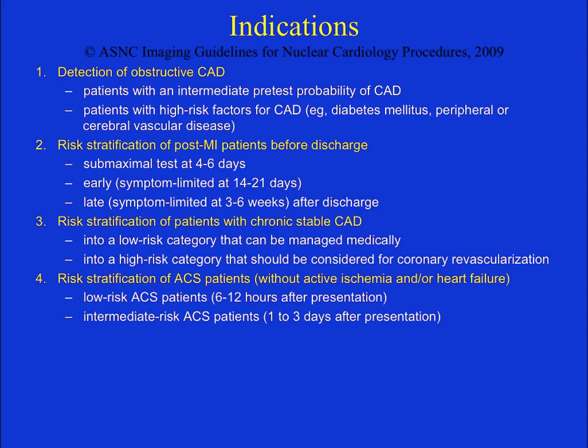Okay, let's go one step ahead. Let's assume that the patient underwent some thrombolysis. Now, after thrombolysis, we can again inject the tracer to the patient and do the imaging again. So we get the post thrombolysis image, and these two sets of images, the previous image, that is the image when the patient was having chest pain, and the later image, that is the post thrombolysis image, these two sets of images can be compared, and we can assess whether the thrombolysis was actually working or not.